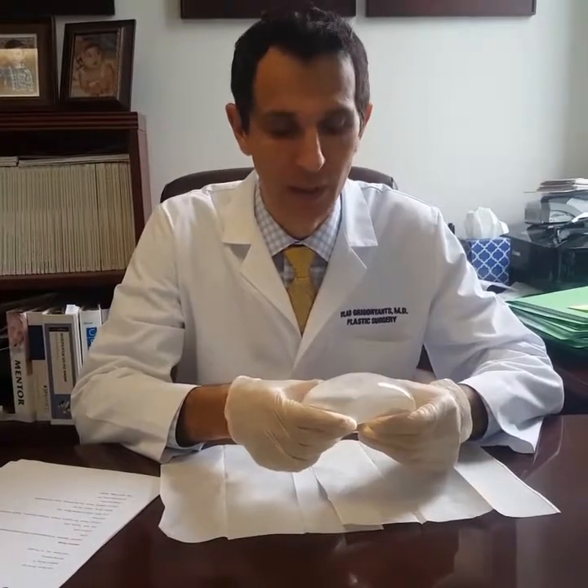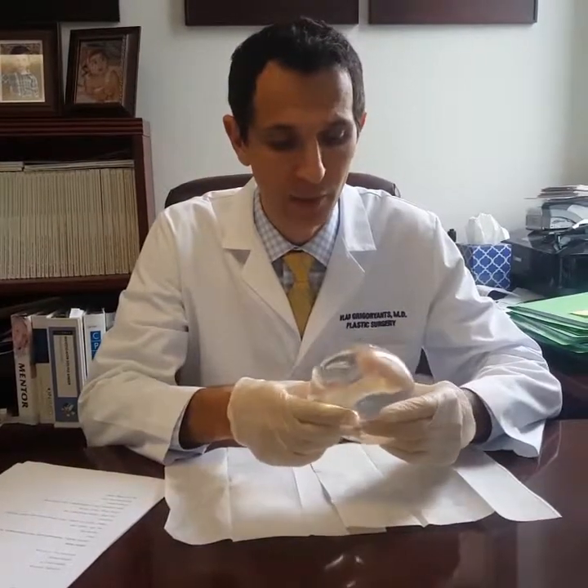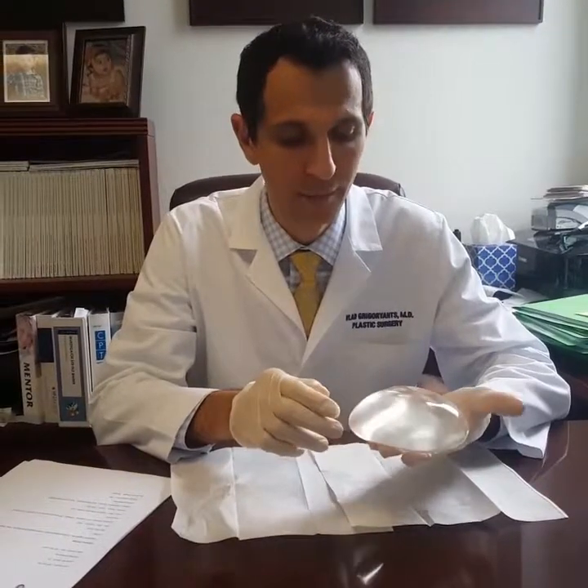Patients frequently ask me what happens if a breast implant leaks. Inside of this breast implant is silicone. These are the newer implants — they're called Inspira implants made by Natrelle. They have cohesive gel.